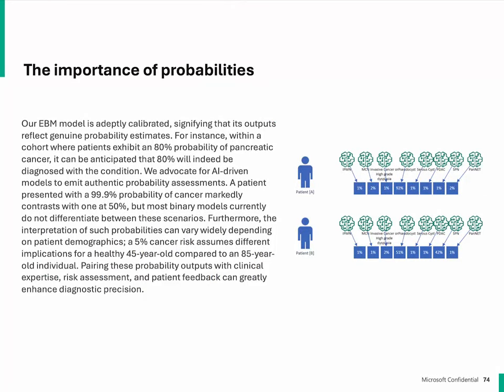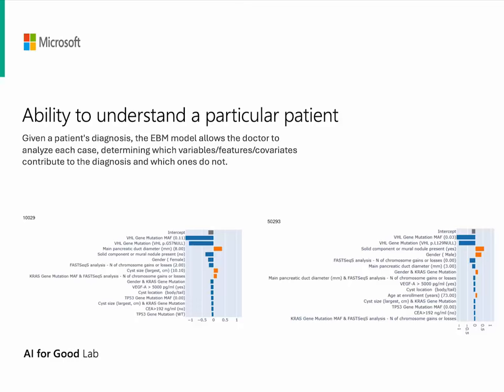An important thing is we don't look at the probability of a population having cancer or having a select finding. We look at the individuals. So in other words, when I'm looking at a patient and you have a cystic lesion, the computer can say, hey, look, this is 95% a benign lesion, or it's 90% malignant. This helps both the clinician as well as the patient make the correct decisions. And so it's very important, this idea of probabilities.